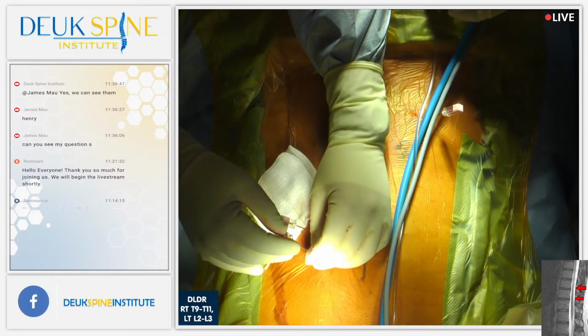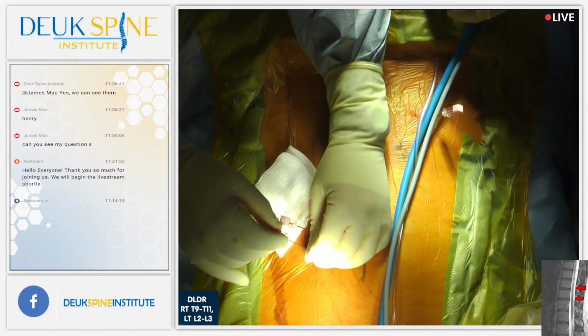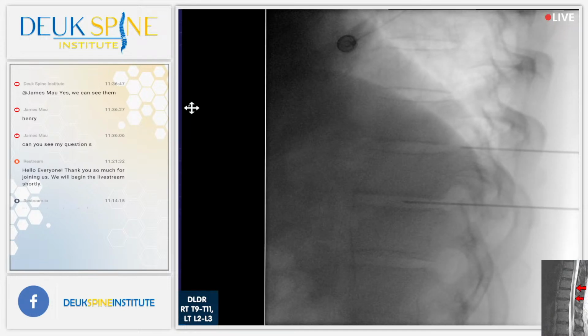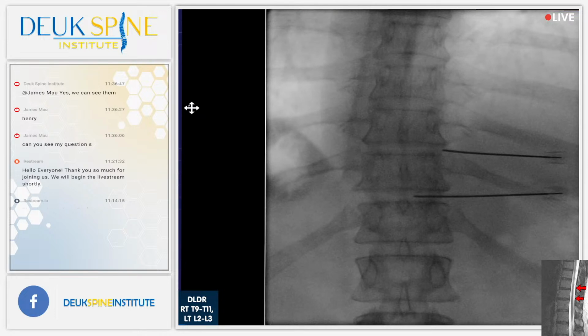All right, welcome back. We are almost done placing needle number 2 while you were watching our video on how discs cause so much pain. And the answer is it's inflammation. Inflammation is something that doctors ignore. When I was a neurosurgery resident at University of Florida in Gainesville, I remember I was really impressed one day. Perfect. Look at that needle, it's perfect. So we got one at 10-11, and we're going to do the next one at the disc above, 9-10.